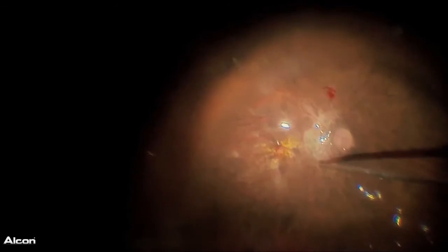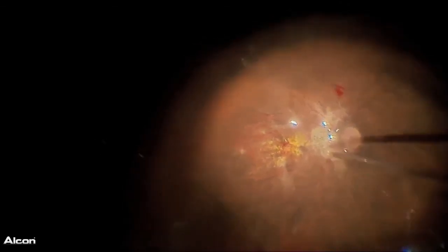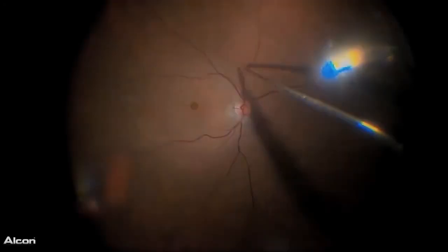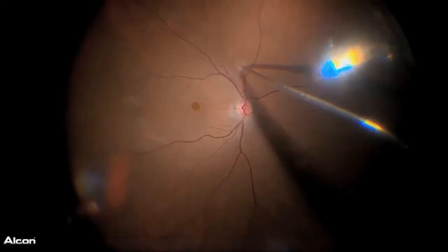And after that, I performed the fluid gas exchange so as not to displace the harvested retina. And it's very interesting, during the fluid gas exchange, I was able to have good images.